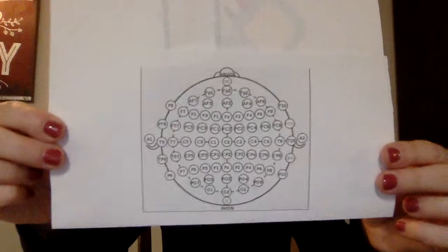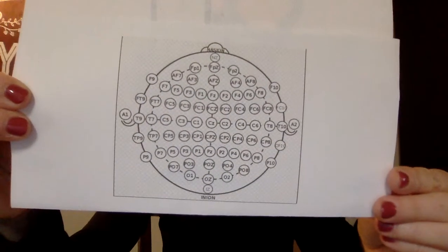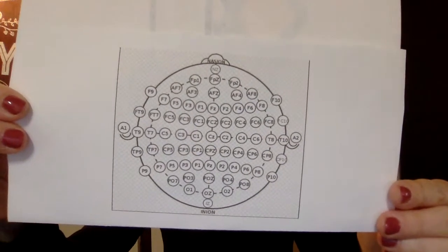Once you've done that, then the electrode placement will need to be determined based on what the patient is working on. So there's TDCS treatment, but you have to pair it with something else. So finding out where you're going to place the electrodes, which stimulate the excitability, is important. So here's an image of all the different places that you could connect the electrodes. So there's obviously a wide variety of places that can be used with this treatment. Placement instructions can be found at totaldcs.com.